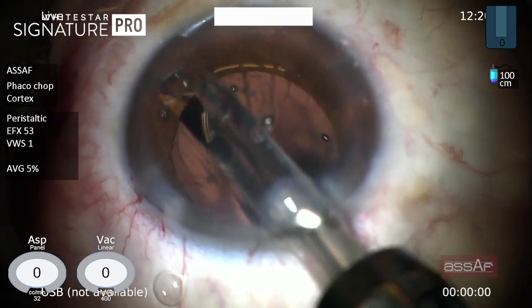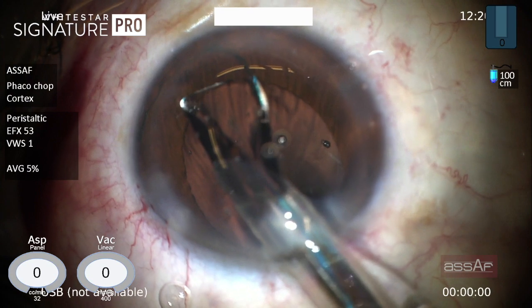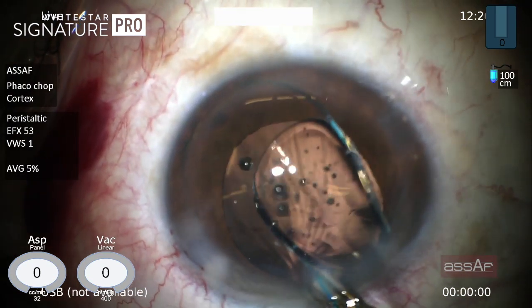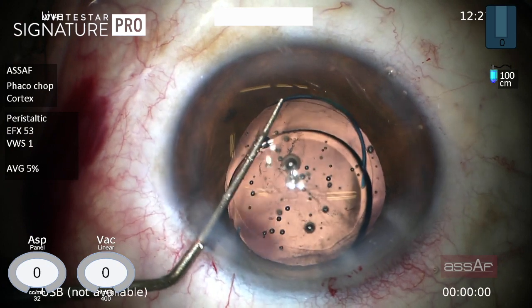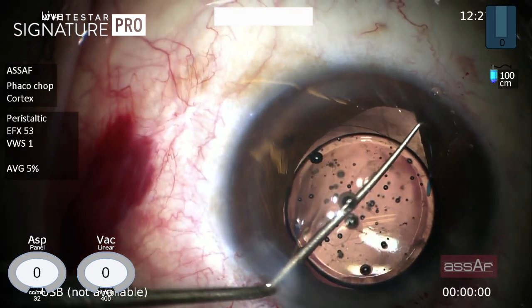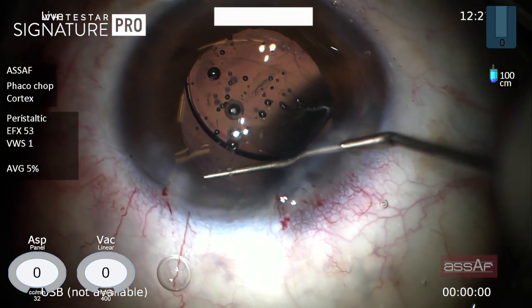Now implantation of a three-piece lens. For sulcus implantation, I initially implant the lens in the anterior chamber. With the Kuglen hook we can flex each haptic one at a time to place it in the sulcus. This haptic has now been placed in the sulcus, and doing the same with the trailing haptic.